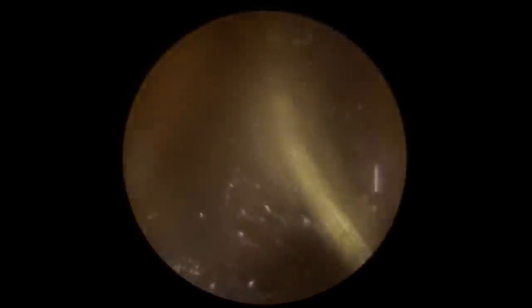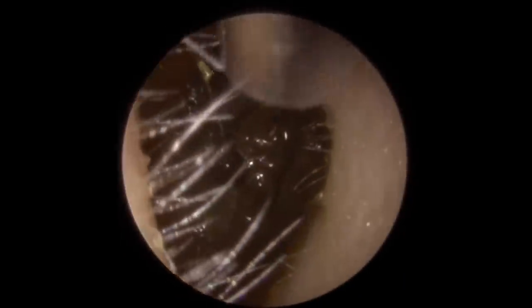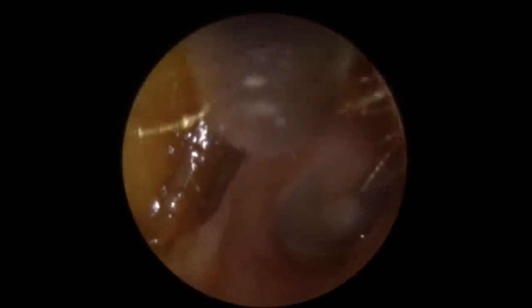Last patient of the compilation now. This patient has come through with very similar issues to the first patient — a very blocked-up sensation first thing in the morning which slowly clears throughout the day, and just a feeling of some squelching in their ears. We've got very soft wax here — you can see we've got a grip on the base section, and the whole bottom section is coming out now. A little bit of skin around the outside edge has held that in place, so it's actually worked in our favour. We'll go back in and we can see another good flap of skin there that gets sucked into the machine, and that just frees up the top section to get rid of.